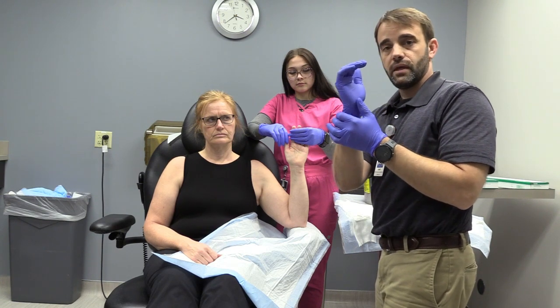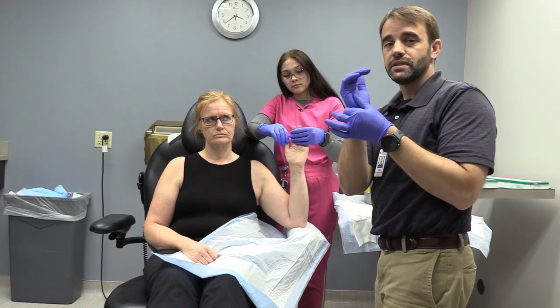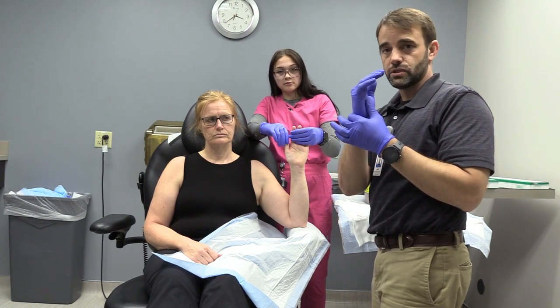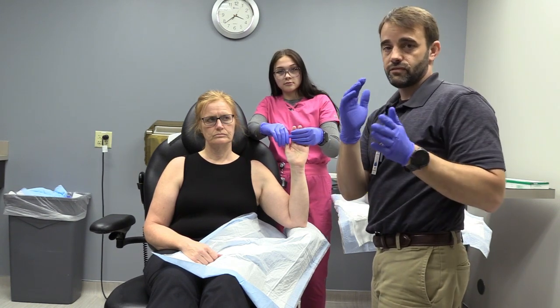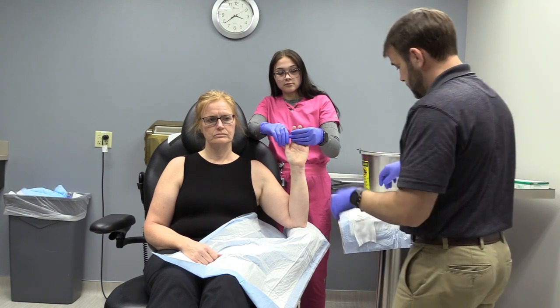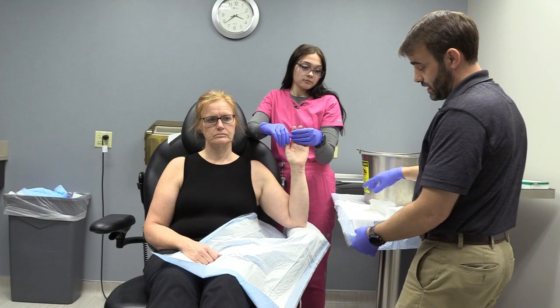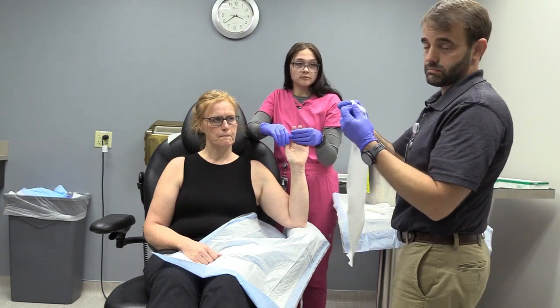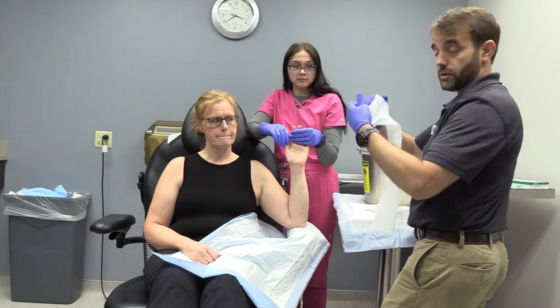Okay, so I'll show you the boxer's fracture because it's the more common one you're going to see. But if your splint is causing pain, always adjust it. Don't go based on what the textbook says in terms of how to position. Base it, especially for temporary use, on patient comfort. So we start off, at least the way I do it, I use plaster, not orthoglass, because I just find that it's more comfortable for most people.